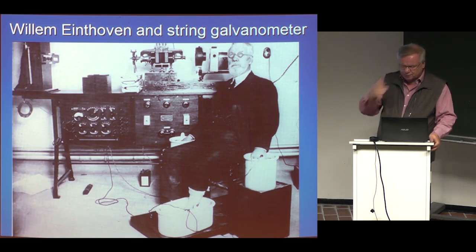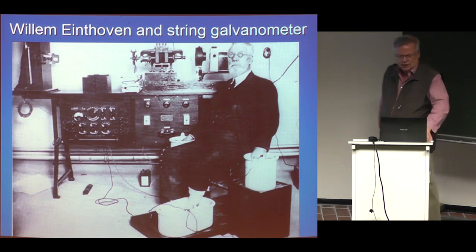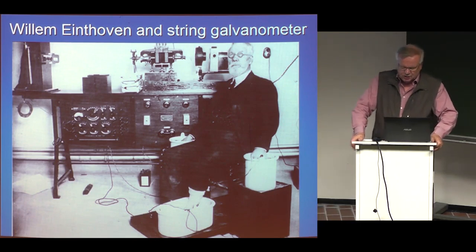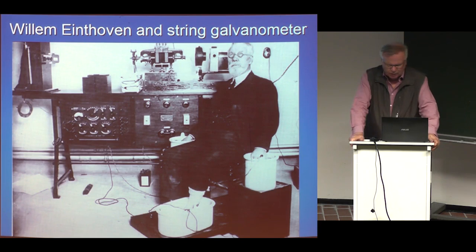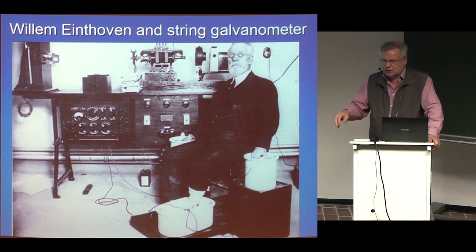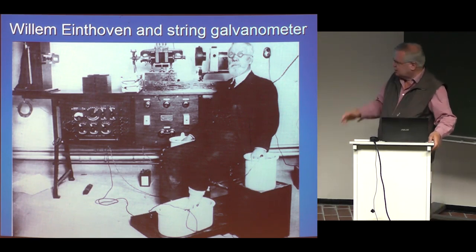But here you see clearly why the Einthoven limb leads are used, or were used and still are used, why the ECG was recorded already in the first experiments from two hands and one leg. The reason is simple. Because the string galvanometer was not a very sensitive instrument, it needed as much electric current from the body, from the electric activity of the heart, as possible. Therefore, the contact impedance in the electrodes should be as small as possible.